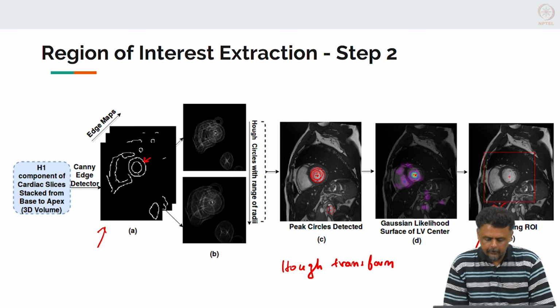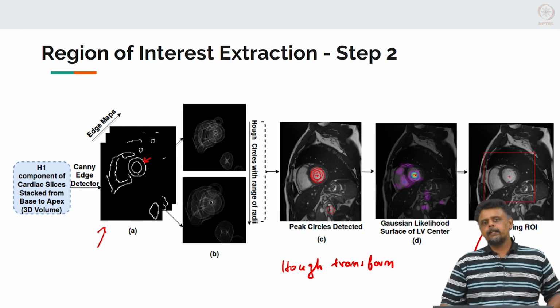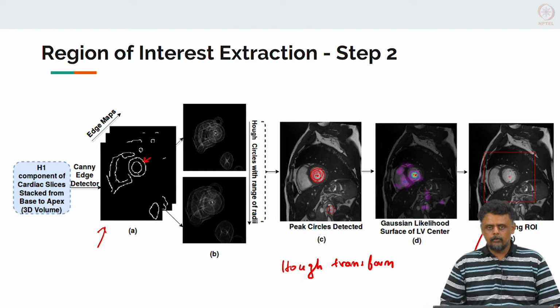Now, on the other hand, you can say that the CNN is supposed to figure this all out by itself, that is also possible. If you do not want to do this crop pre-processing which involves localizing the left ventricle, you can feed the entire image directly to a CNN as input. It is going to be a slightly more difficult problem to solve because there is so much other confounding anatomy present. But in general you can do either of these approaches.